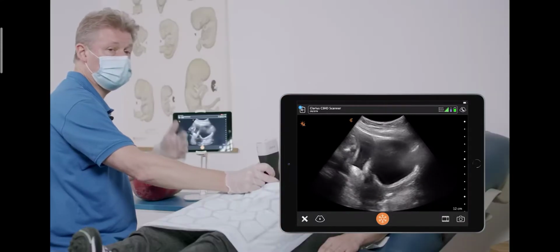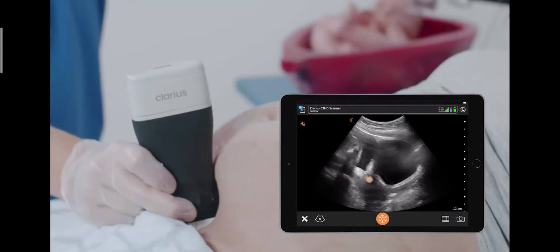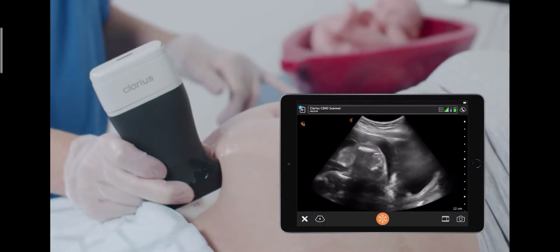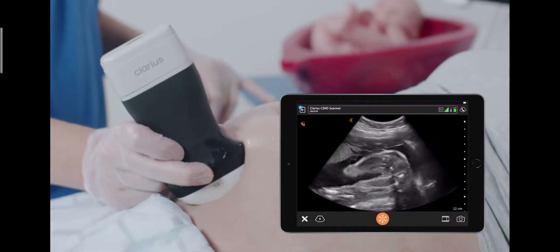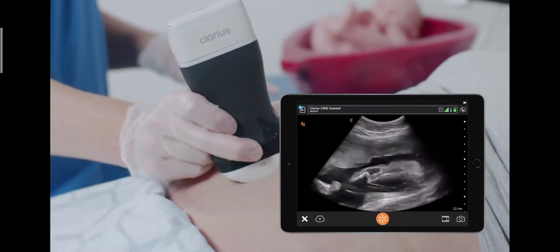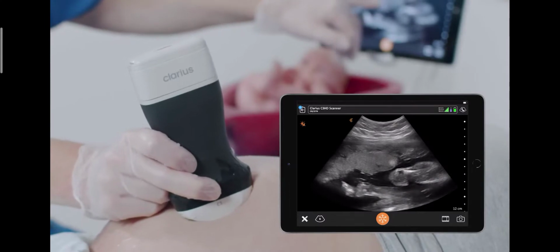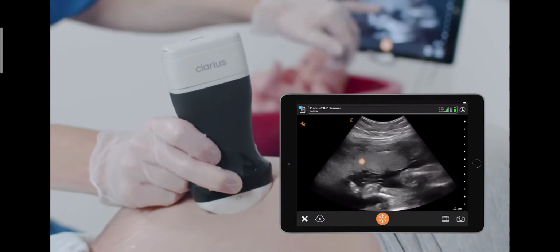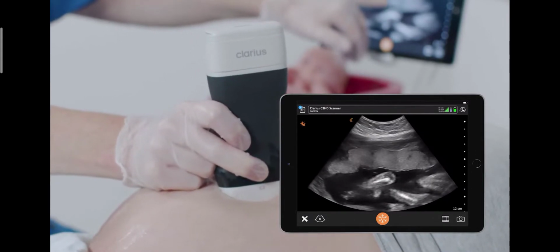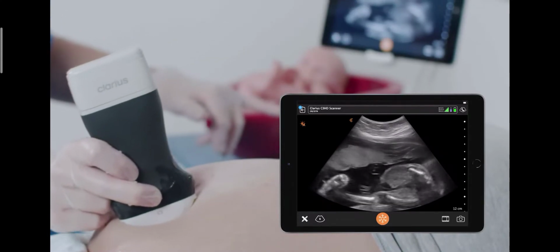After I'm moving up in sagittal view, trying to identify the position of the placenta, in this case the placenta is anterior, the surface of the placenta here, and the placenta looks like a unique structure at this stage. I'm coming back just to show this again. So here you can identify the cervix of the uterus, and you can see this lower segment of the uterus, and the placenta is very high in this case. So I am moving up in order to understand how far away the placenta is, and you can see that it's going up to the fundus, so it's not covering the cervix.